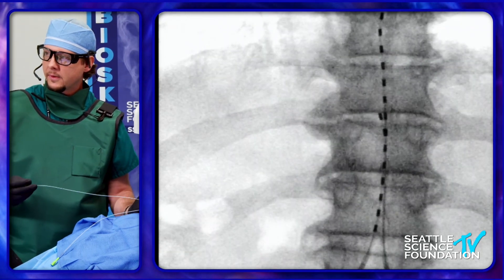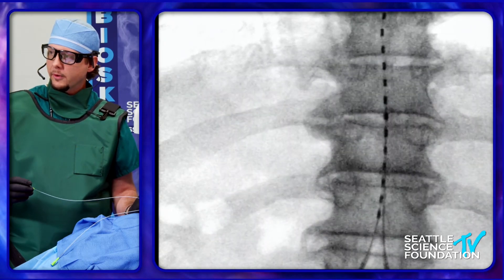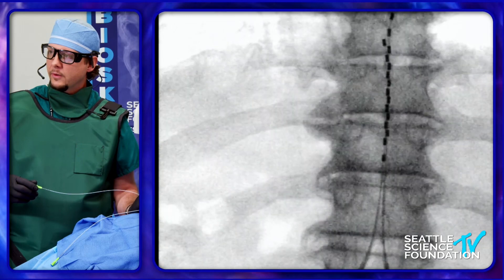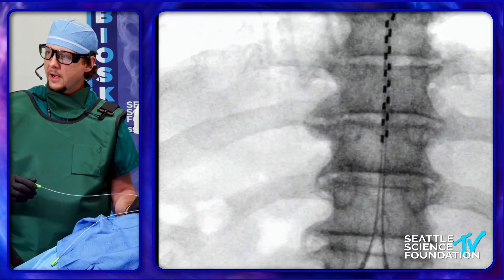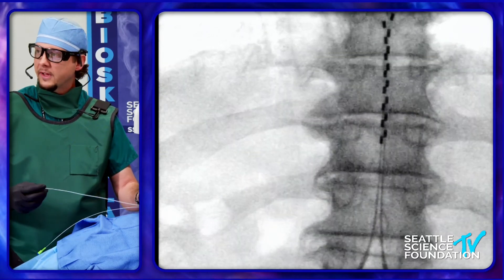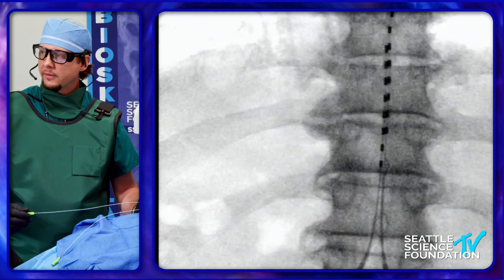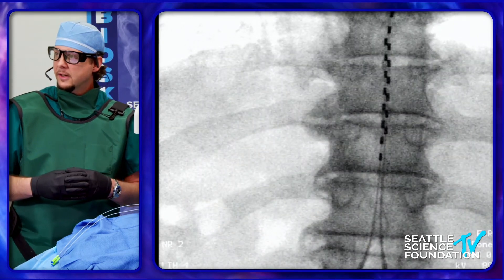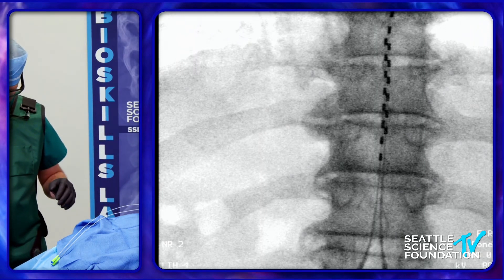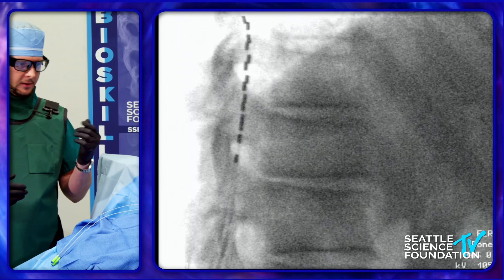We'll keep advancing. We don't want the leads lined up on top of each other — it's best if they're side by side. It's okay if they're crossing over a little bit, but not where the terminals are. You can see they've rested there at about T8. Maybe get one up a little bit and stagger them to get coverage optimally from about T8 down to the bottom of T10. We'll confirm a lateral again — we're posterior there.